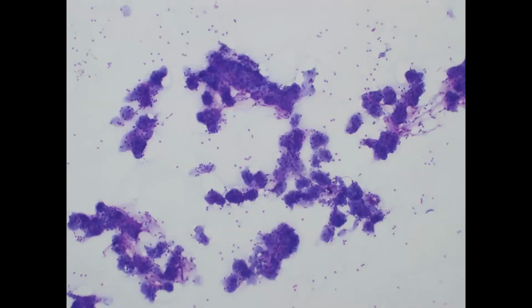So we'll start off with just the normal findings in a salivary gland aspirate, so just normal cytology that we see in this site. So again, we have both serous as well as mucinous salivary glands. The parotid gland is going to be almost entirely serous, and so here's an aspirate from a parotid gland.